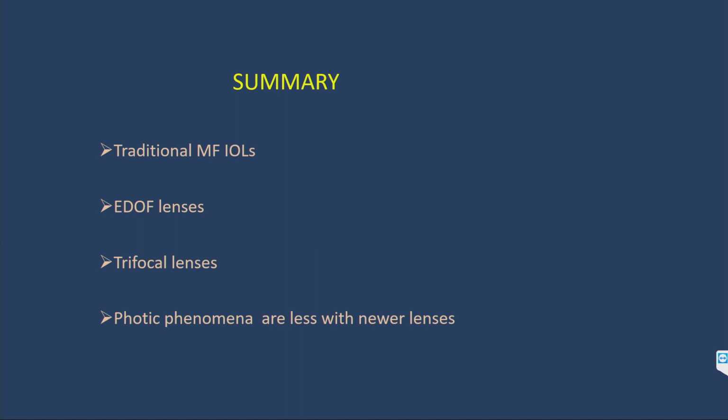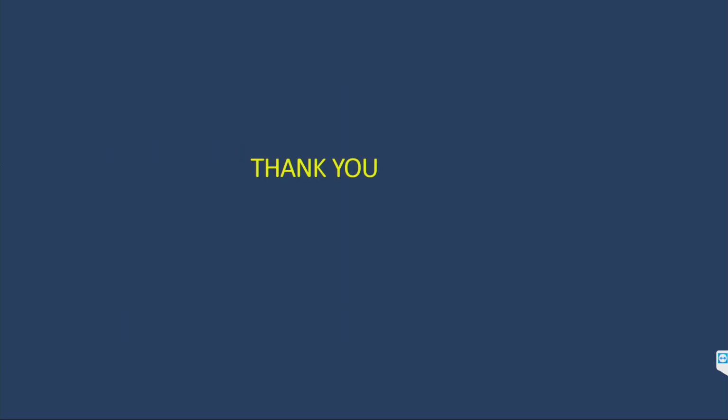So in summary, the traditional multifocals were bifocals. They gave good distant and near vision, and the intermediate vision was poor, but they had high photic phenomena, so they are slowly becoming out of practice. And the next is the EDOF lenses. For them, the distant vision and the intermediate vision was good, and the photic phenomena were comparatively less because they didn't have distinct focal points, but the trade-off was decreased contrast sensitivity. And the trifocal lenses have comparatively less photic phenomena and have reasonably good distant, intermediate, and near vision. So we have to select from this platter for the better outcome of our patients. Thank you.